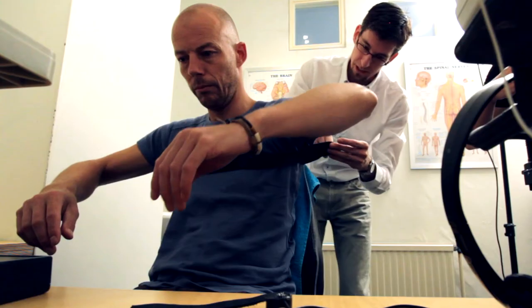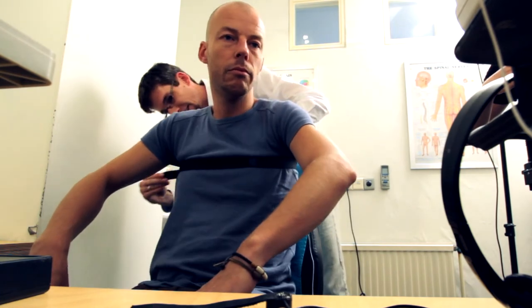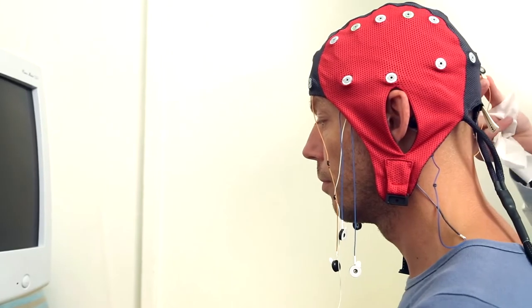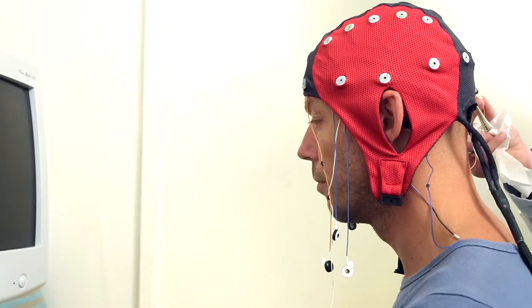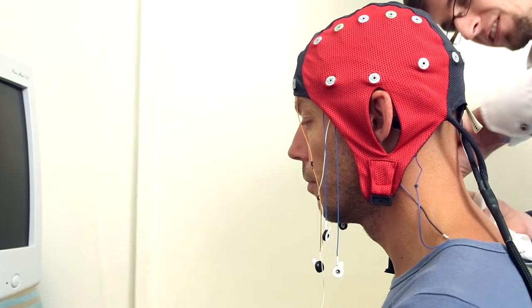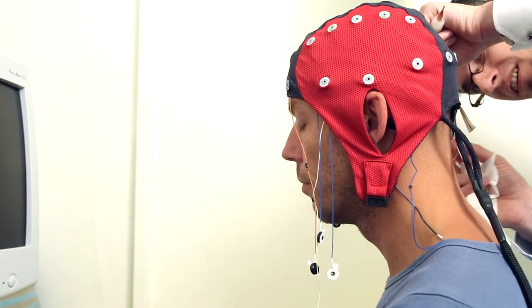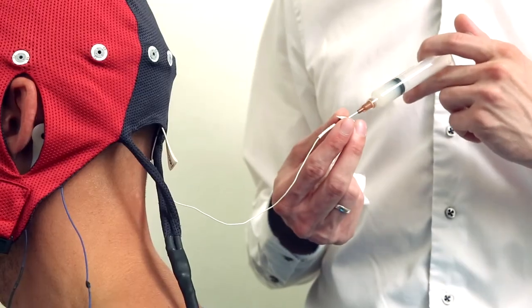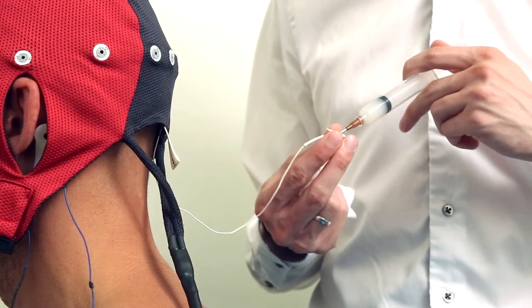After the conversation, the researcher and client proceed to the room where the assessment takes place. The client is then fitted with a strap around the chest to measure respiration. The researcher places a specially selected cap on the client's head. This cap contains electrodes that measure brain activity.